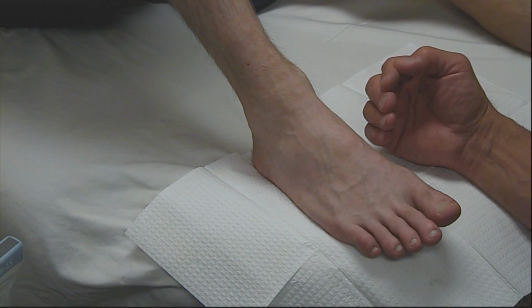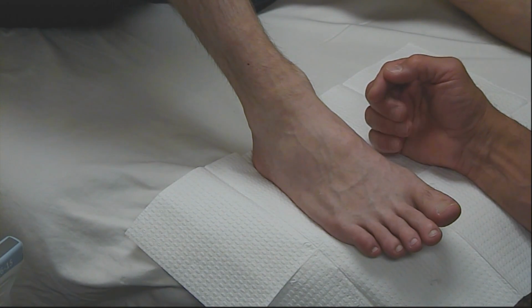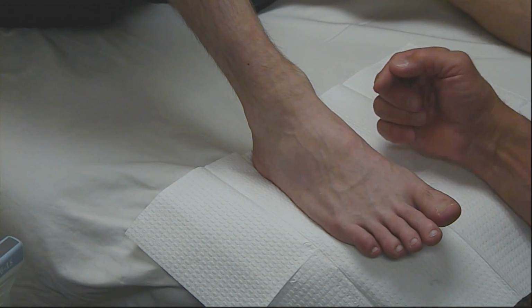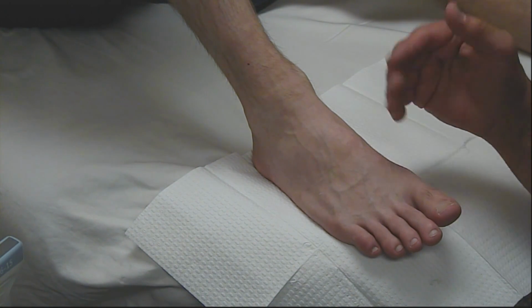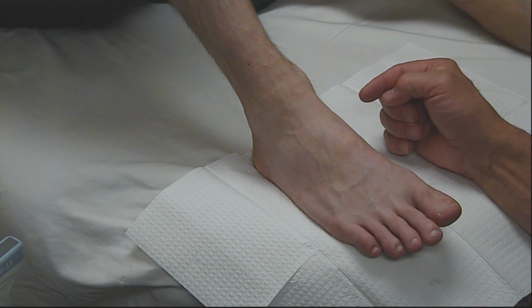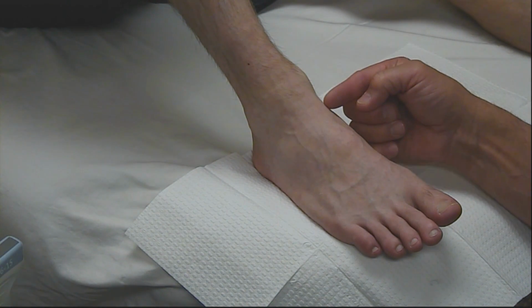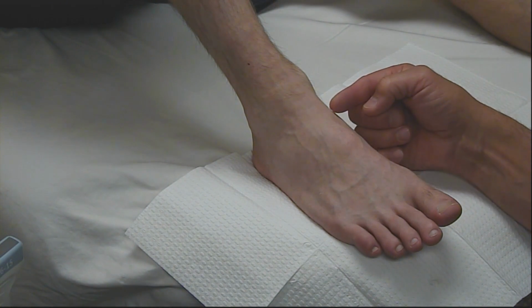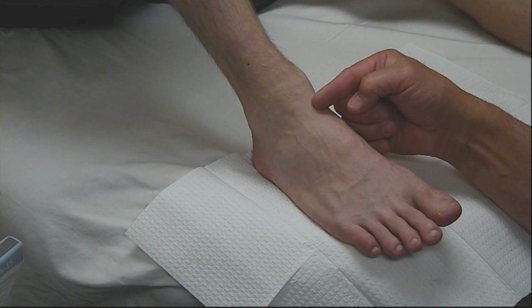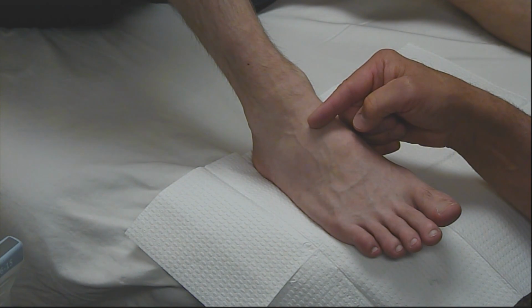To initiate our process of looking at the ankle, we always do it in a systematic approach. In the systematic approach, we'll improve our efficiency and make sure that we don't miss anything or any of the major structures. When we evaluate the ankle, we start on the medial aspect, looking for the tibialis anterior, moving laterally to the extensor hallucis, and further lateral till we see the area of the extensor digitorum.